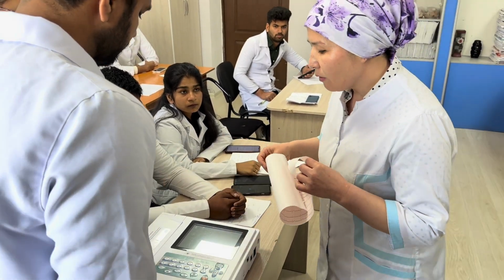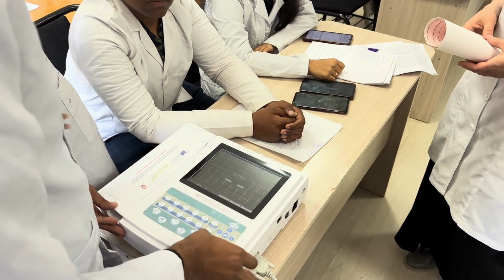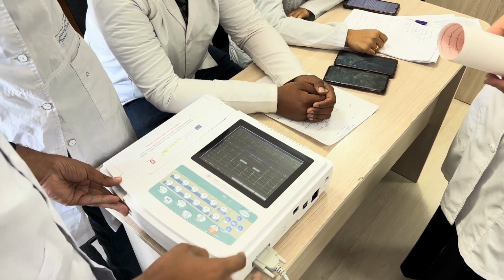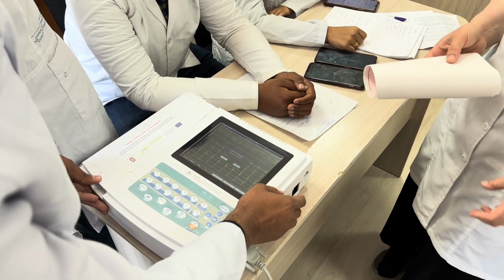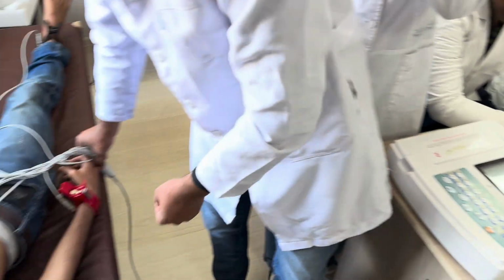Now please finish. Turn off. We stop the ECG, then we turn off the machine, and we remove the leads, firstly from the patient.